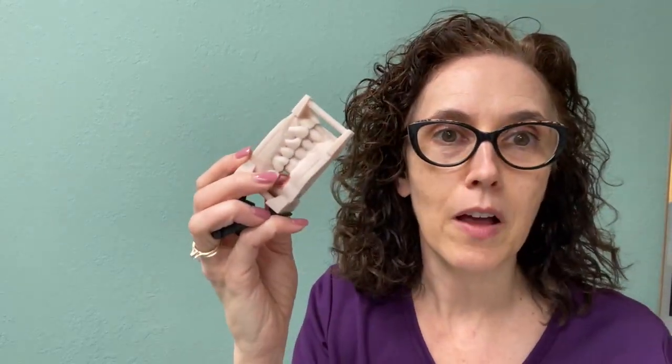Those 2 pieces can be separate pieces, so that an abutment is then screwed into the implant and a crown is cemented on top of that. Or sometimes the laboratory will fabricate something called a screw retained abutment, which means that the crown is already on that abutment, as one piece, and you don't need to cement anything into place. Instead, you're able to screw it in all as one piece. So this is an example of that case.